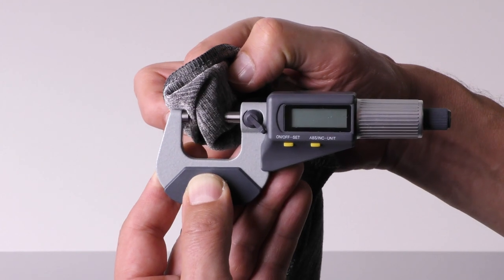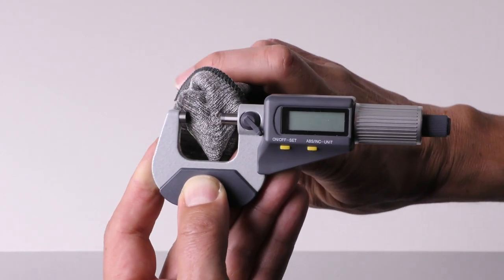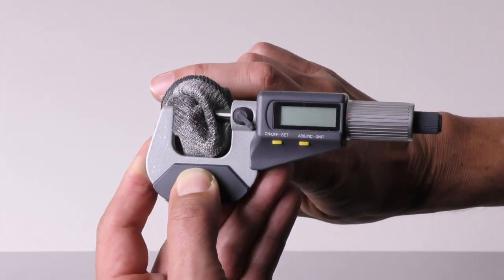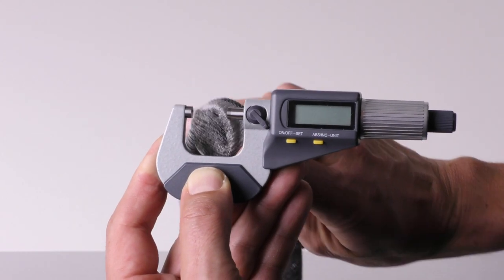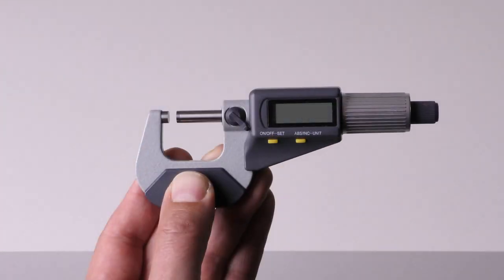Before using the micrometer, make sure that the measuring surfaces are absolutely clean. If necessary, use a clean cloth. Before you can start measuring you have to set the zero point of the micrometer. Without a correct zero point, all measurement values will be incorrect.